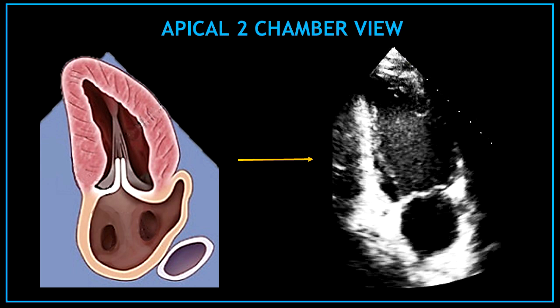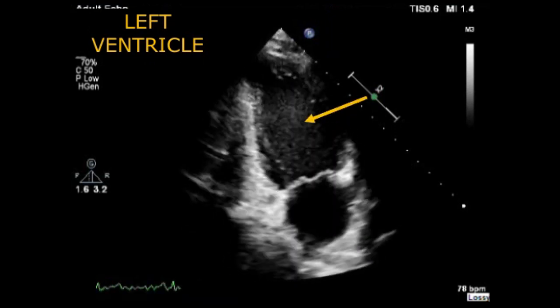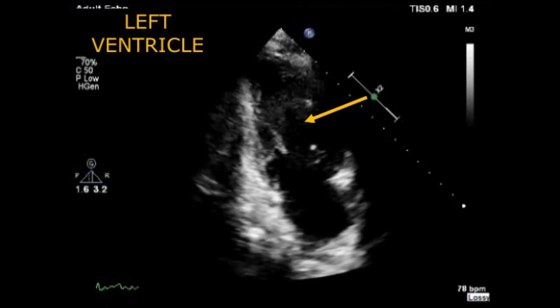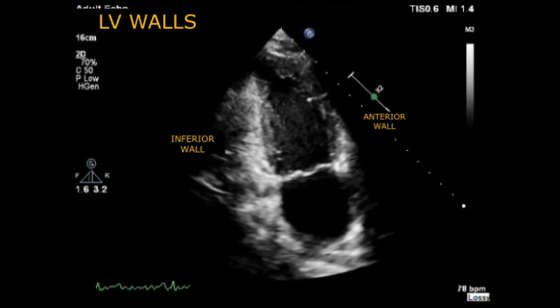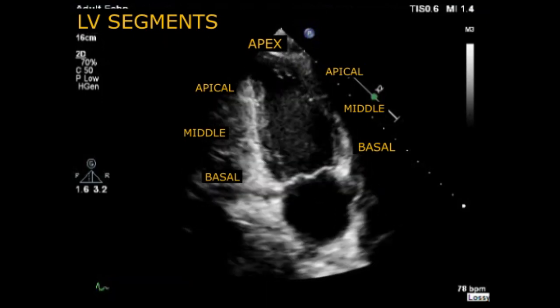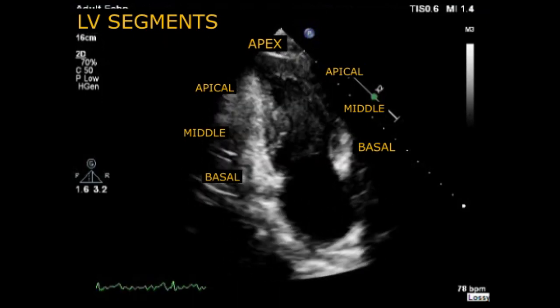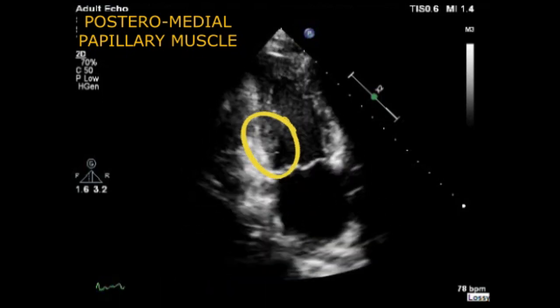Now, once again, let's review one by one all the structures visualized in the apical 2 chamber view, but this time on a video. The top chamber is the left ventricle, and the left ventricular walls visualized here are the inferior wall on the left hand side and the anterior wall on the right hand side. We can also analyze all the different ventricular segments, and inside the left ventricle you can find the posteromedial papillary muscle.